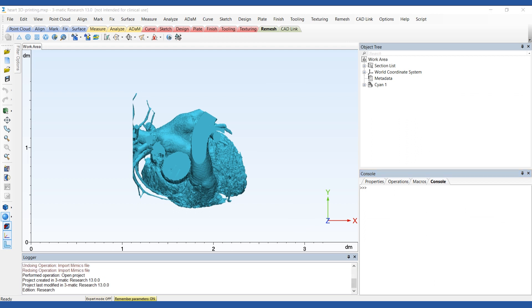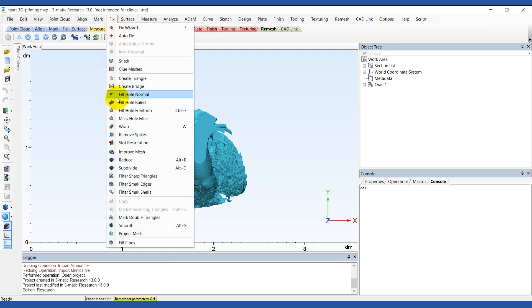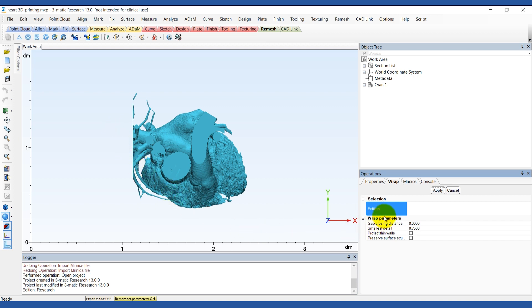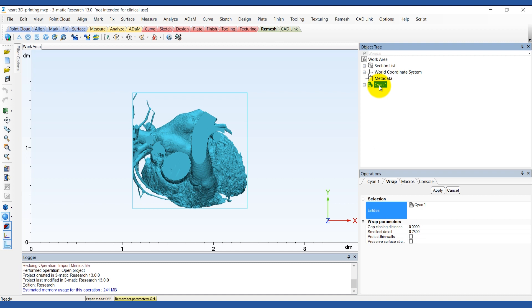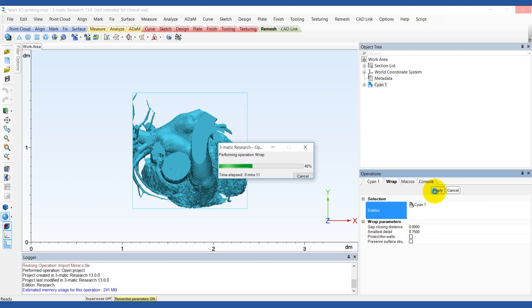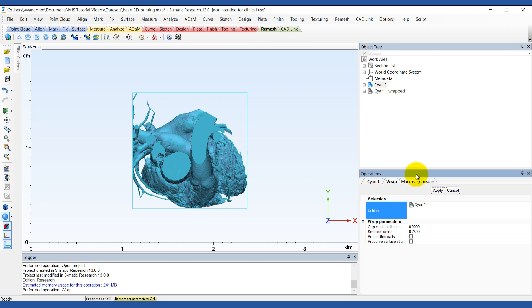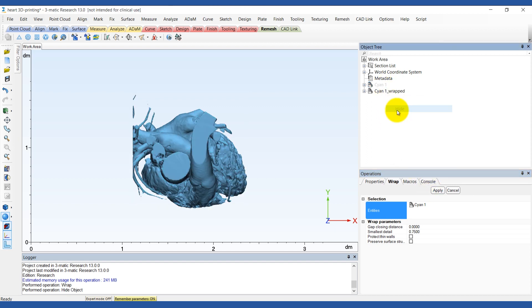The first thing we typically do in 3-matic for these hard models is a Wrap operation. This tool is found in either your Fix or your Design menu. Choose the heart as the entity. This tool does a shrink wrap around your part — it can close any holes on the surface, smooth it out, and remove any internal shells, making your model a watertight and easily printable file. Keep the cap closing distance at zero. For the smallest detail, don't use a really high value unless you need it, or it will take a long time to calculate. For this model we're going to keep a value of 0.75 mm, meaning all details smaller than 0.75 mm will be lost. Once done, you'll notice a new part in the object tree that is smoother than the original.